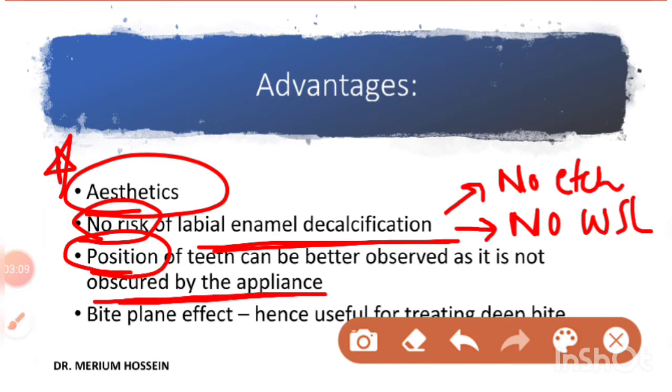So the fourth advantage that needs to be explained, and it is a kind of conceptual advantage, is that we can get the bite plane effect through lingual orthodontics, and it is very important in treating patients with deep bite. So I'll make a diagram to explain that to you guys.